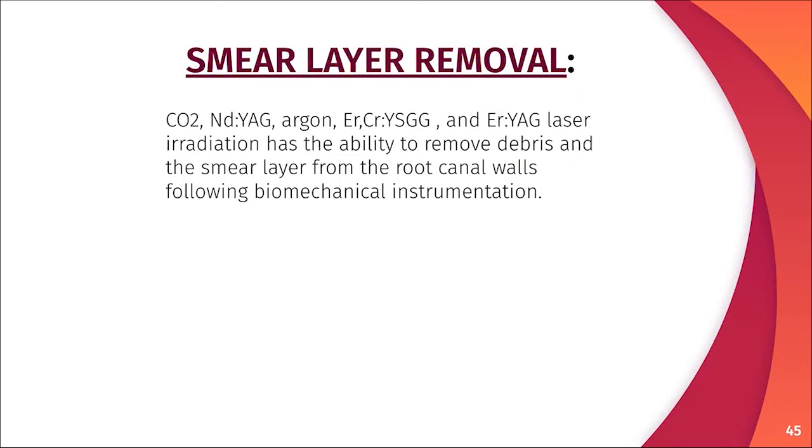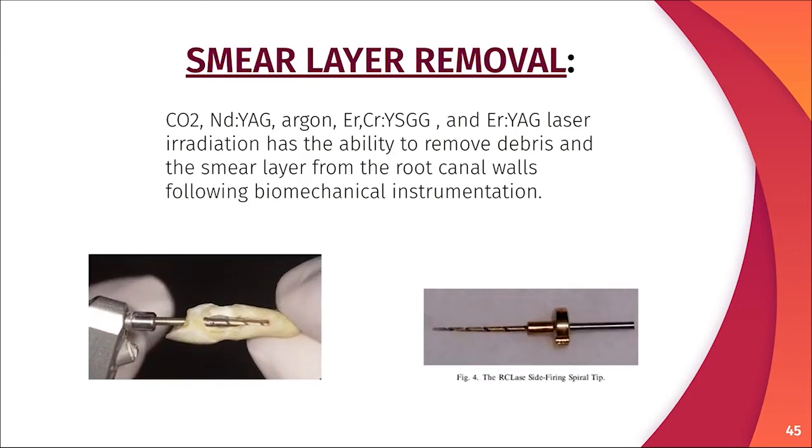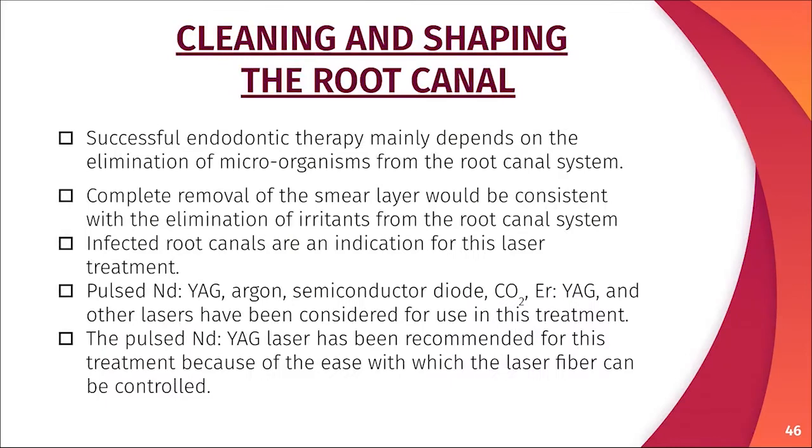Smear layer removal. Carbon dioxide, Nd:YAG, argon, erbium, chromium YSGG and erbium YAG laser irradiation has the ability to remove debris and smear layer from the root canal walls following BMP. That is biomechanical instrumentation. Cleaning and shaping of the root canal.